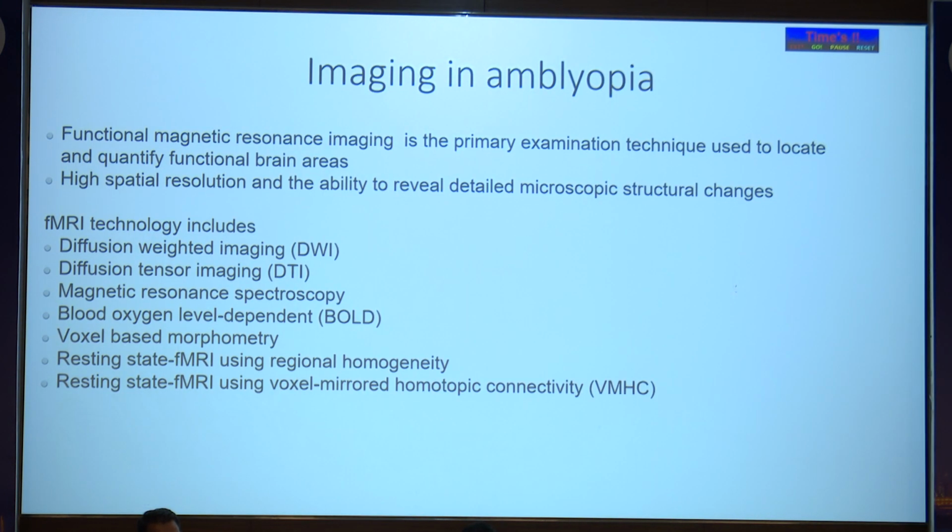So these are a few of the indications which I have shown in strabismus. These are not the only indications; you can even do it whenever you see any complex case. Imaging in amblyopia is really just for research purposes.